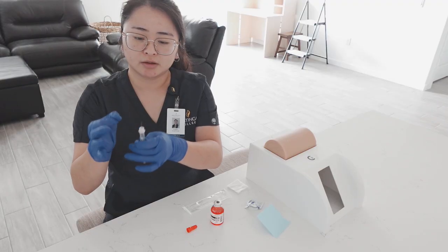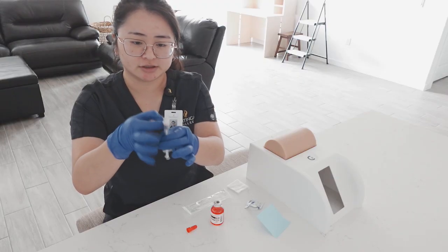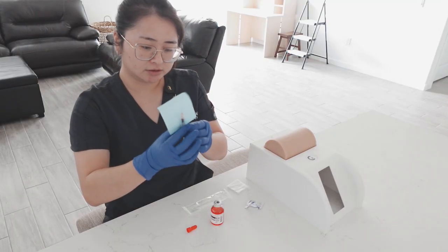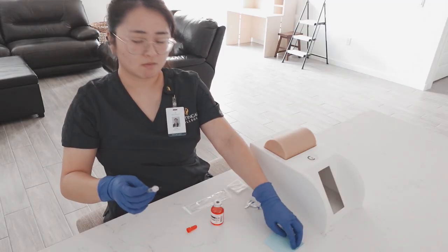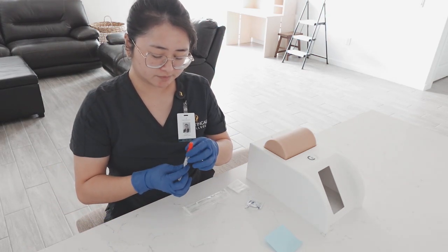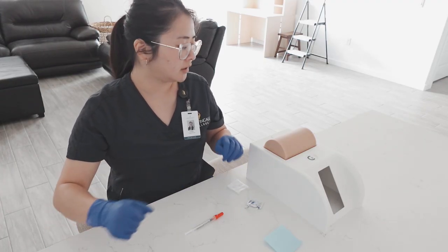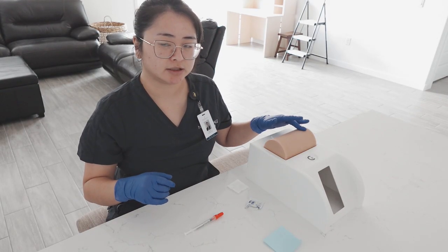If there are bubbles, then we will flick our syringe. I'm going to show you that it's 0.1 milliliters. 0.1 milliliters. Okay, so now that that's correct, we're going to use the swoop method. Let me put this on the side. We're going to use the swoop method. Go like this. Put that down for now. Throw that away. And then we're going to also assess the site for any lesions, any discoloration, and we're going to palpate for any tenderness.